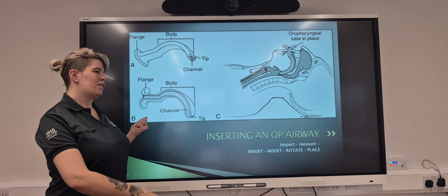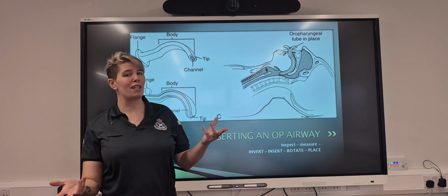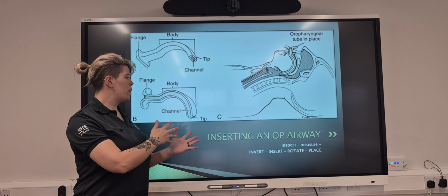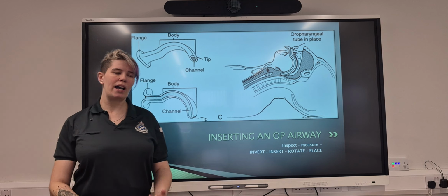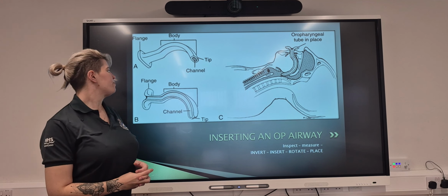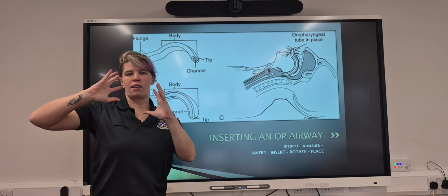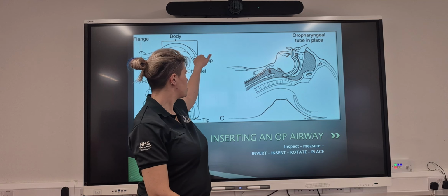That is all fine and well, but if you've got many hands available, which we don't have the luxury of, usually there's going to be 2 of you at a cardiac arrest. So what we do is we use airway adjuncts to maintain that airway for us. For you guys, that adjunct is an oropharyngeal airway or OP airway. How it works is just as you can see up here. When it's properly inserted, its duty is just to lift the tongue off the back of the throat. There's a hole through it to allow for oxygen to pass through.